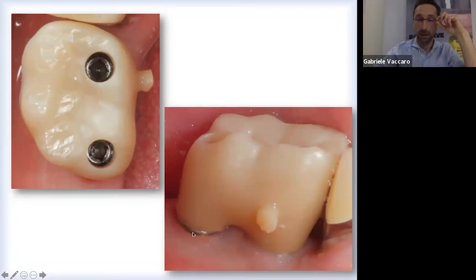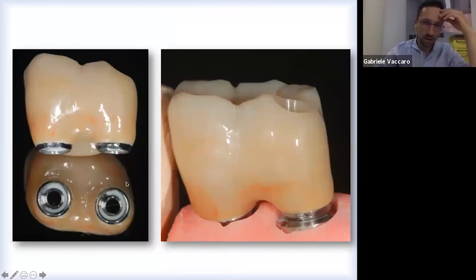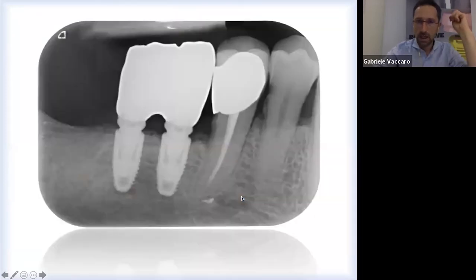Since I have the connection, I brought the connection right at the gum level or a little bit above the gum level, it's easy to check without X-ray, just checking by visual enhancement. And this is the finished product in the lab and in the mouth. This is the crown, now cut and polished, perfectly polished. And now I treat this exactly as it was a single crown for its tooth.